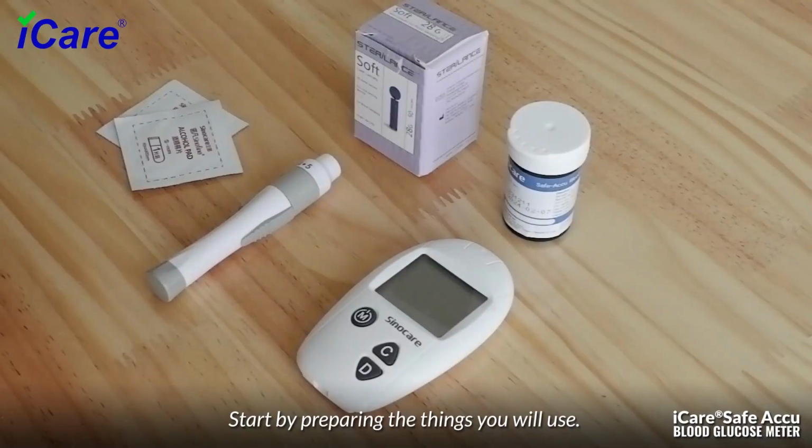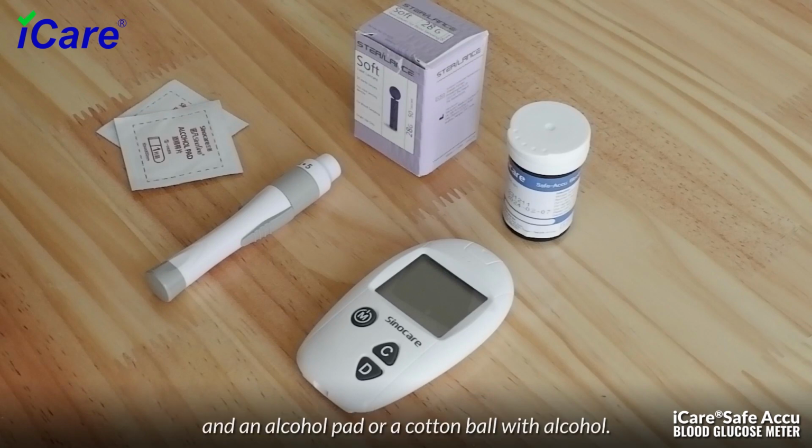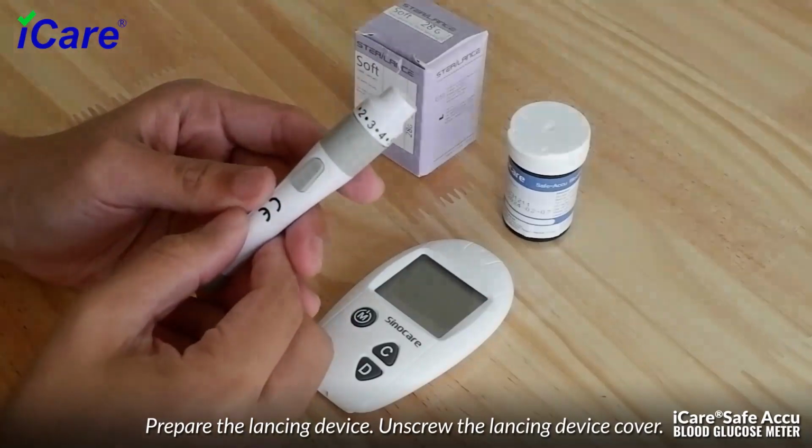Start by preparing the things you will use. You will need the meter, the lancing device, a sterile lancet, a glucose test strip and an alcohol pad or a cotton ball with alcohol. Wash your hands thoroughly. Prepare the lancing device.